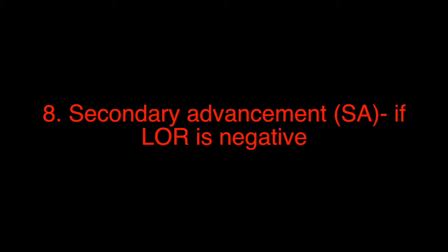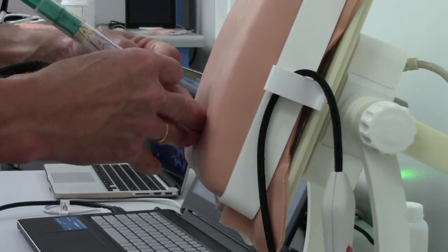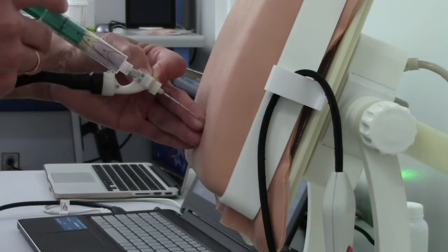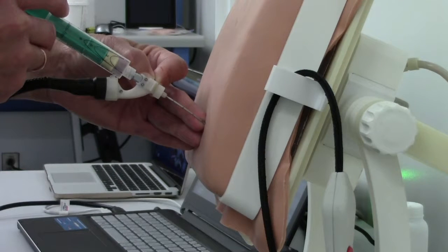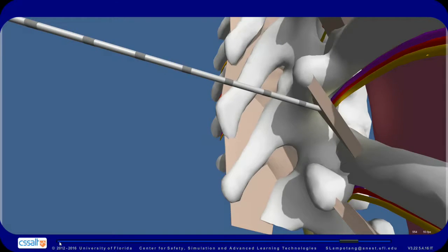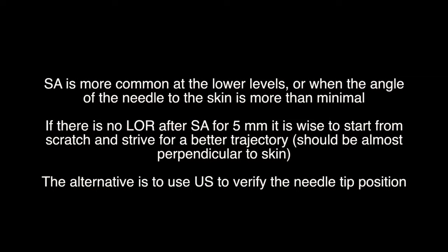If loss of resistance is negative, after noting the depth of the needle at the skin, we start secondary advancement for five more millimeters or until loss of resistance, whichever comes first. We split secondary advancement into three increments — two, two, and one millimeter — checking for loss of resistance after each increment. Secondary advancement is more common at the lower levels or when the angle of the needle to the skin is more than minimal. If there is no loss of resistance after secondary advancement for five millimeters, it is wise to start from scratch and strive for a better trajectory.